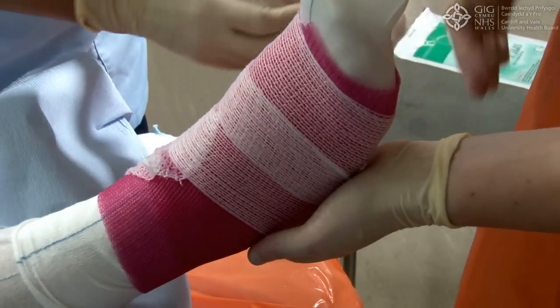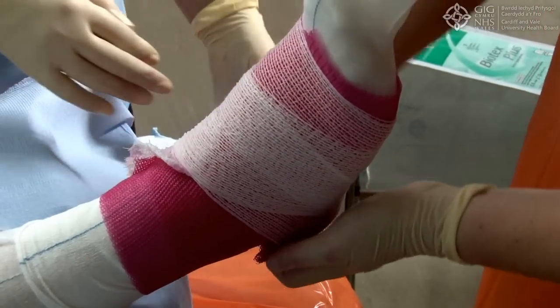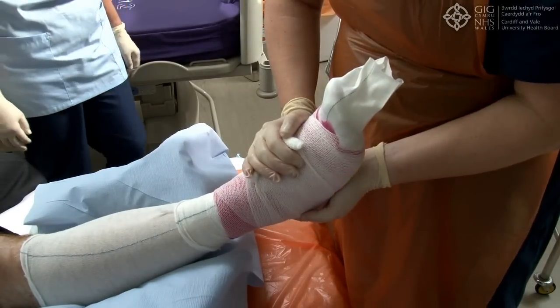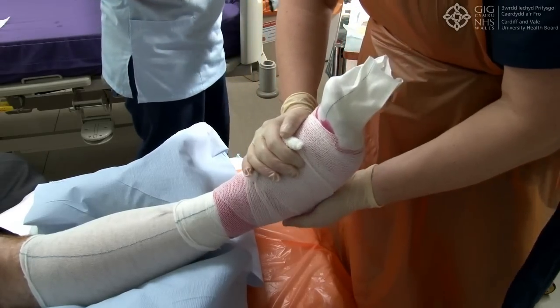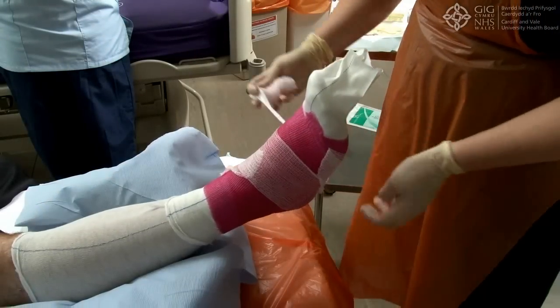Apply dampened bandage over the semi-rigid casting tape to allow the cast to set. Leave to set for 4 to 5 minutes until the cast becomes less tacky and hardens. At this stage, if required, change gloves. Remove the dampened bandage and discard.